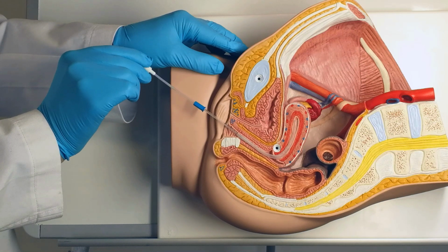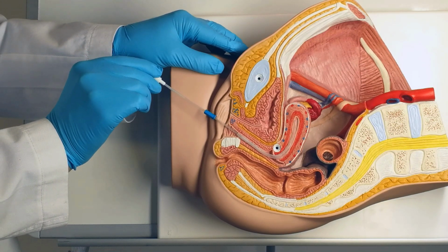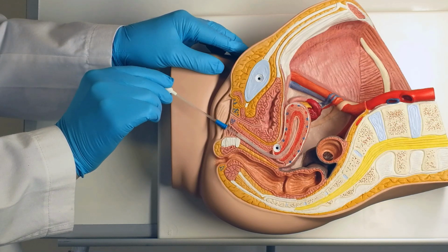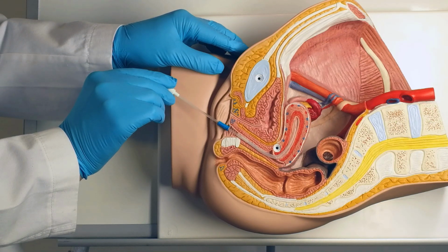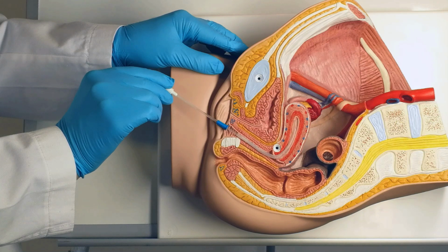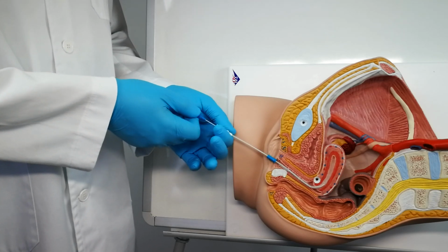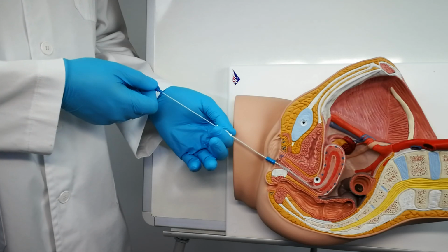In the introduction of the catheter into the vagina, any contact with the vaginal walls must be avoided. Then it will enter through the cervical os to the uterus, where touching the uterine fundus or scratching the walls of the uterus must also be avoided. Once the catheter is introduced inside the uterine cavity, remove the mandrel or guide.